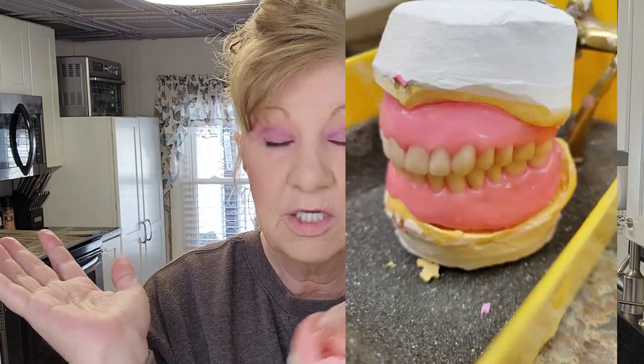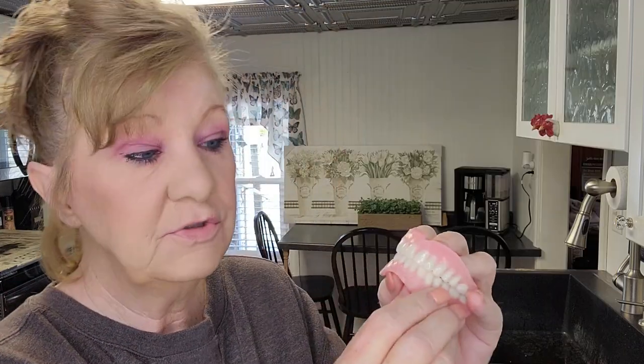He sent back a wax try-in — there it is, my wax try-in. I was able to look at the tooth shape. I was even able to put this in my mouth over top of my teeth just to see what it looked like. My dentist said, do whatever you want with it — feel comfortable with it — because the first time you see your full set of teeth is weird. It's just weird.